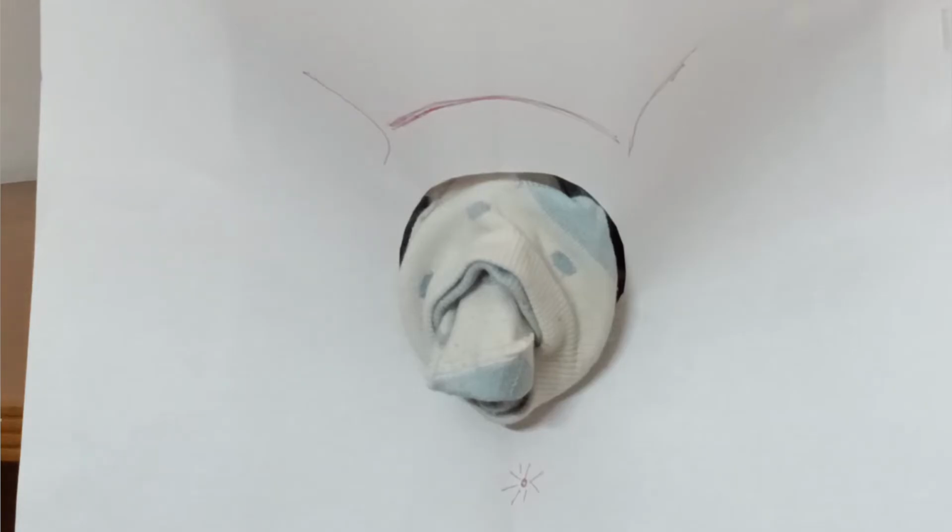Now next coming on to the anterior compartment points, that is AA point. So now we require a Sims speculum or something to retract or clear the field so that we can have just the focus on the anterior vaginal wall.